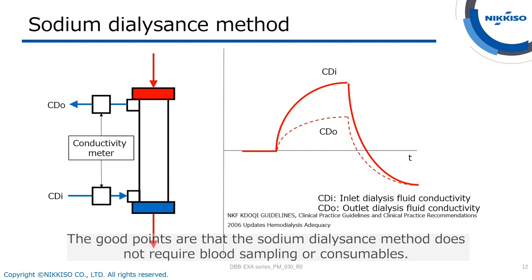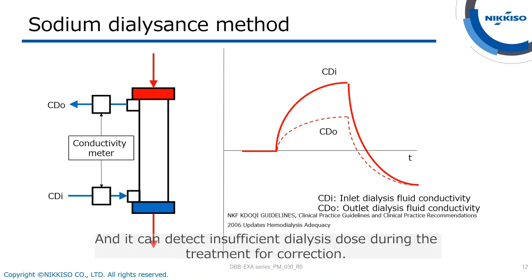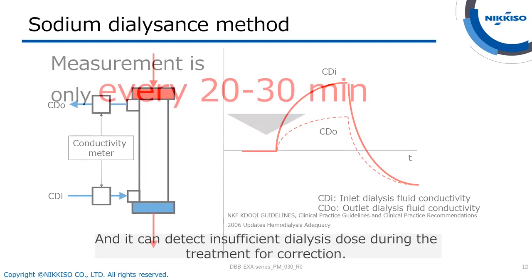The good points are that the sodium dialysance method does not require blood sampling or consumables. Therefore, it can be used at every treatment. And it can detect insufficient dialysis dose during the treatment for correction.